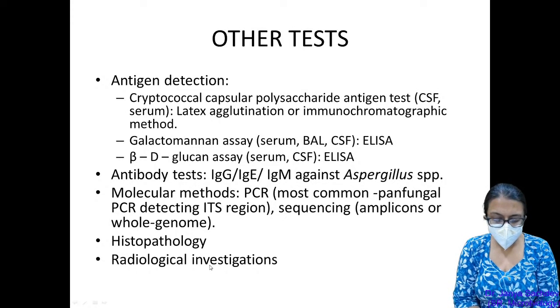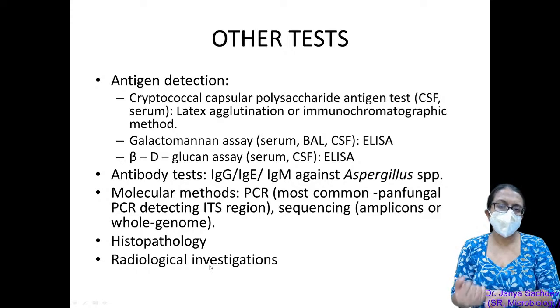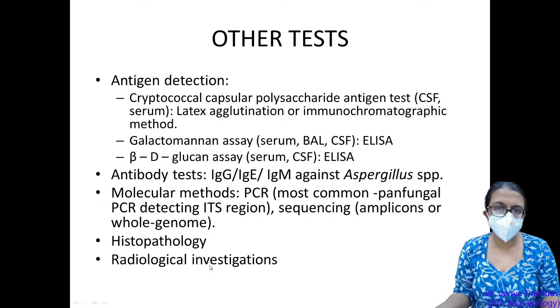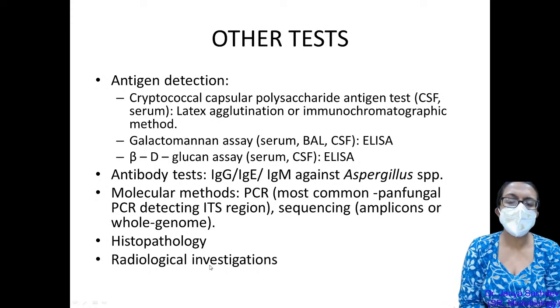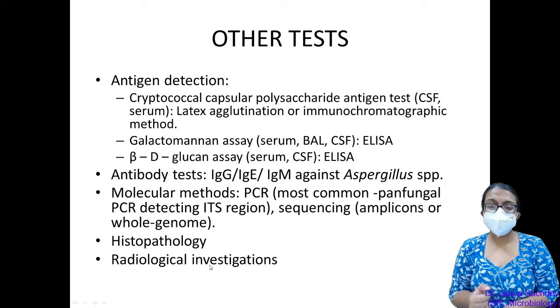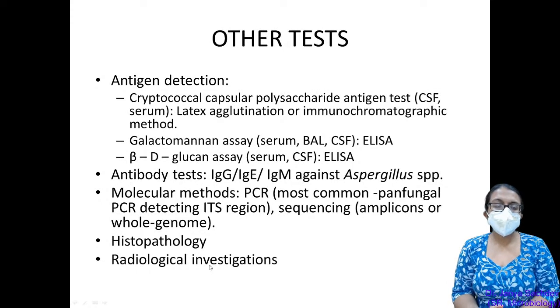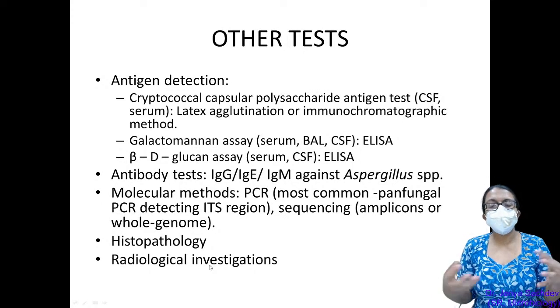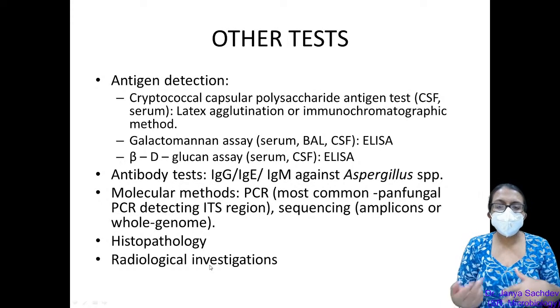If you have any doubt as to how to proceed, which drug, what should be given, you can very well call either the microbiologists or the infectious disease faculty if they are there at the institute where you're working, and discuss it with them that based on this direct microscopy report, what antifungal can we start. Clinical history is very important for us in mycology because of the high presence of environmental contaminants, and because clinical history and what is clinically suspected really changes what kind of processing we do.